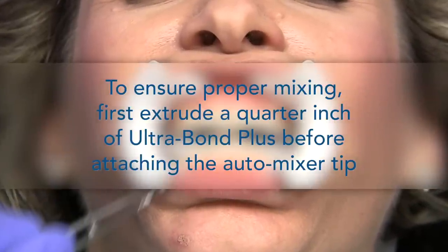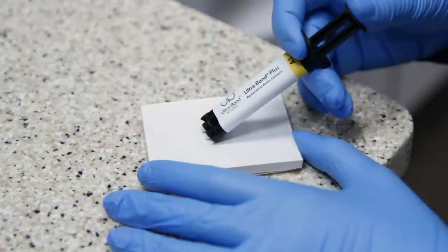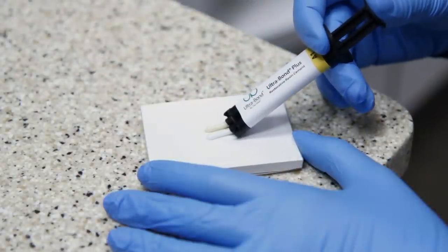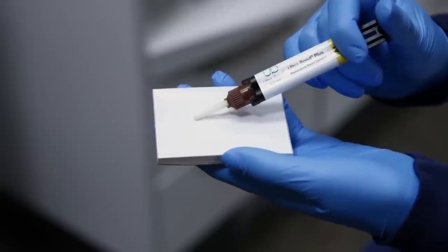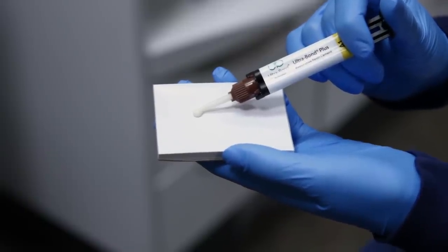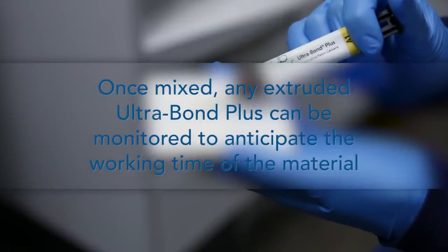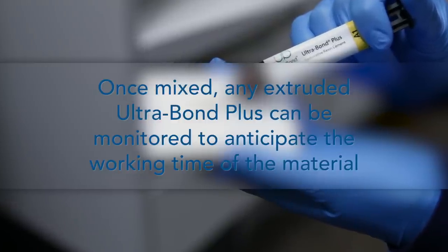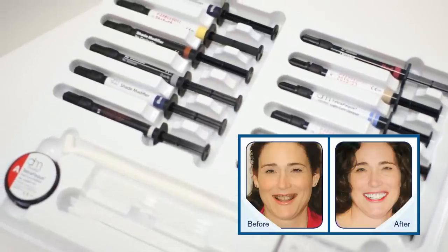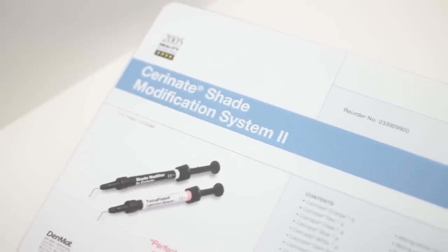Prior to placing the auto-mixer tip on the Ultrabond Plus syringe, always extrude a quarter-inch line of material to ensure adequate mixing. We suggest that the clinician dispense a small amount of Ultrabond Plus onto a mixing pad a minute or two before beginning placement and monitor it for working time, to provide warning in the event that placement takes longer than anticipated. If the patient has dark stains such as tetracycline stains, we recommend Denmat's Custom Shade Modification System 2.